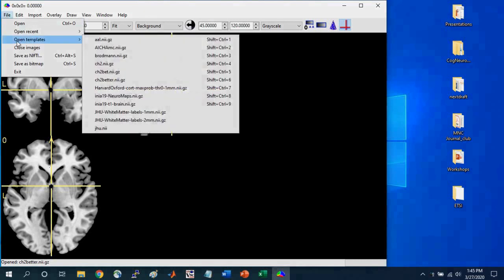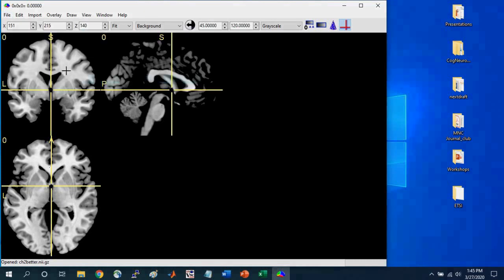Which is a default template brain that's used as kind of a standard for navigating the brain and viewing the brain with different overlays, such as statistical maps or something to that effect. And so this, by default, comes with MRI-Cron.